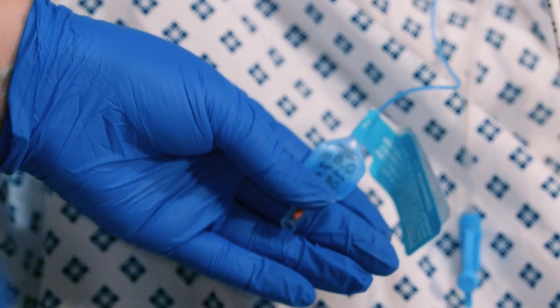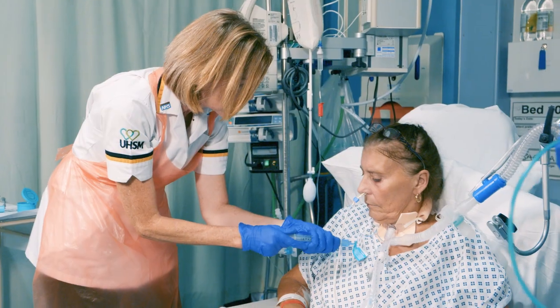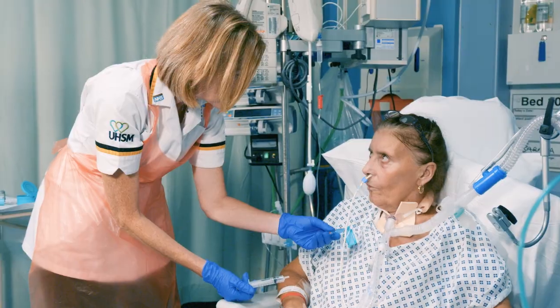Too high a pressure might lead to necrosis of the mucosa and potentially a tracheoesophageal fistula, which can be very difficult to manage. And sometimes with cuff pressure, we find we're having to add extra volume into the balloon, which might be a sign that the tube's just not quite sat in the right position.